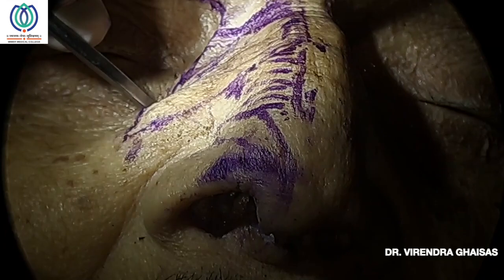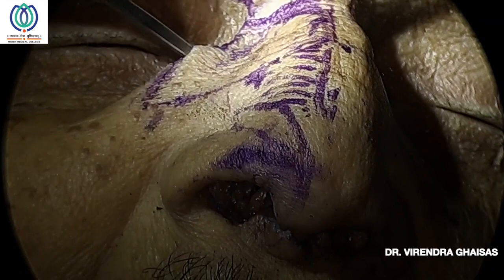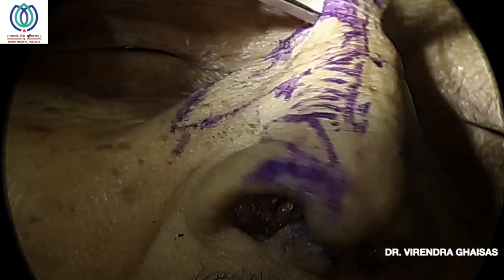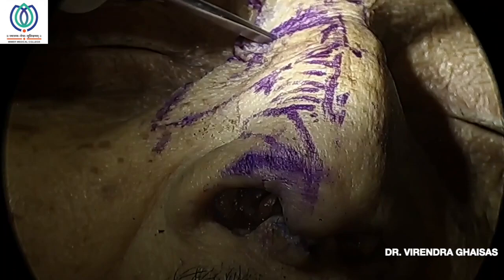You can also do this with a low to high osteotomy, and then later you can fracture it blindly with the pressure of the thumb and complete the osteotomy to mobilize all the nasal bones, or the nasal process of maxilla and the nasal process of frontal bone. The osteotomy is really important in deviated noses, to avoid the open roof deformity in hump noses, and in saddle noses if it is broad, to make the nose narrow. The osteotomy has a major role there.